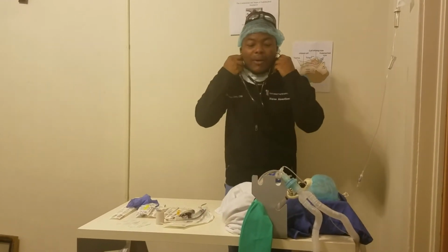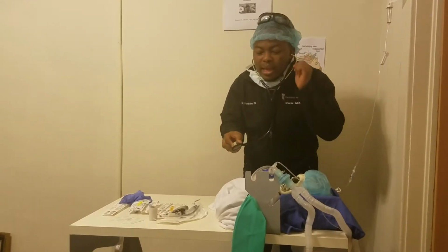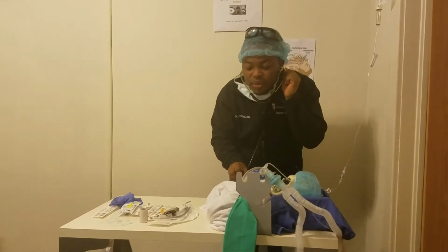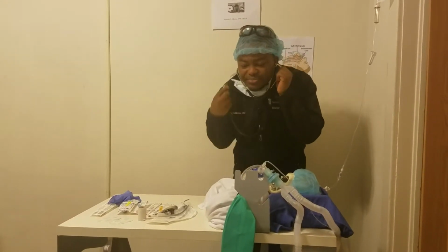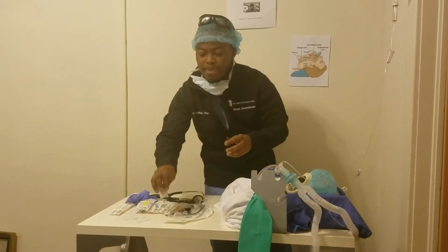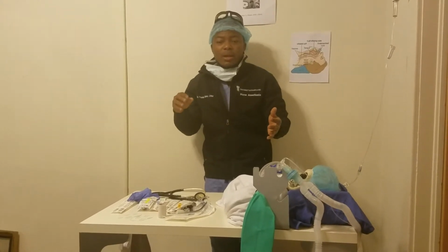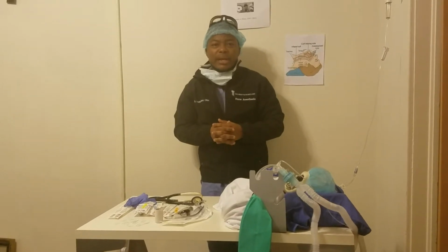Our end tidal monitoring helps us confirm, in addition to condensation in our mask, and then we listen for breath sounds as depicted in the video, and we try to ensure we can hear it bilaterally, both on the right and on the left side. In which case, once we confirm that the tube is taped in place along the patient's mouth, and then we turn on the ventilator, or we continue to hand mask and ventilate the patient. This concludes the steps for endotracheal intubation and the tutorial on the process.